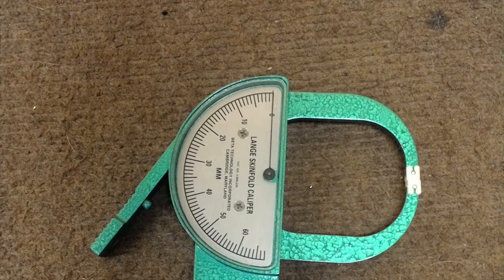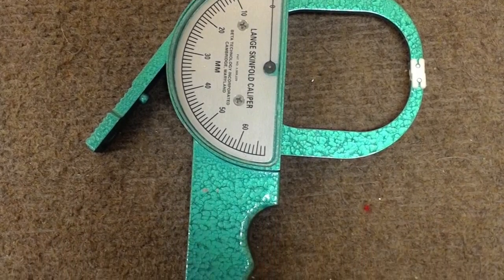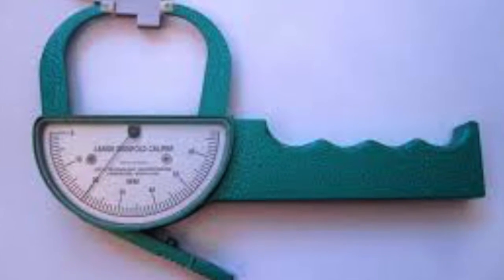Hello everyone! In this video, I will demonstrate how to measure body composition using the 7-Site Skinfold Measurement Procedure. The measuring tool we will be using will be a caliper. Ensure that the caliper you are using is properly calibrated, as it can result as a factor of an incorrect measurement.